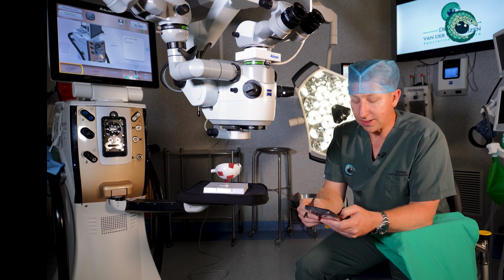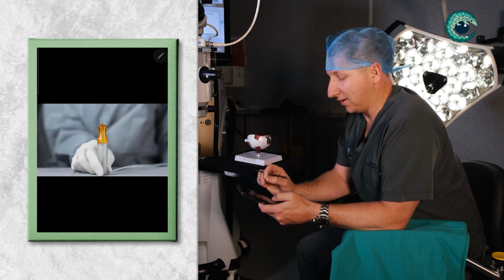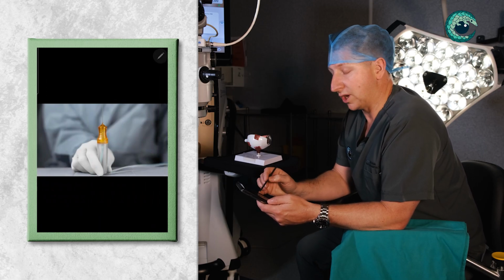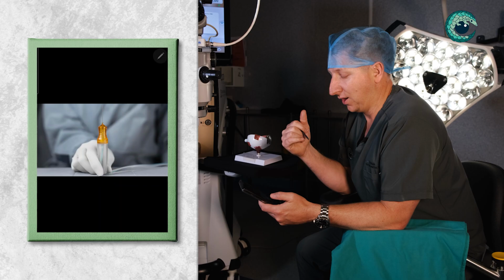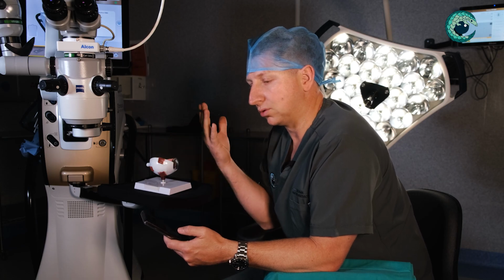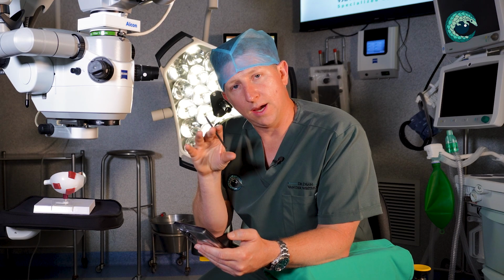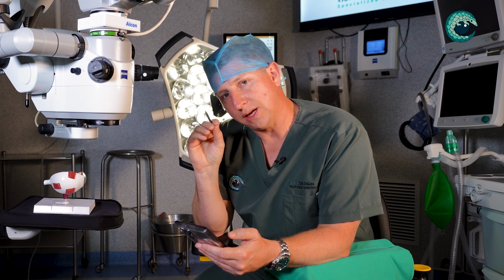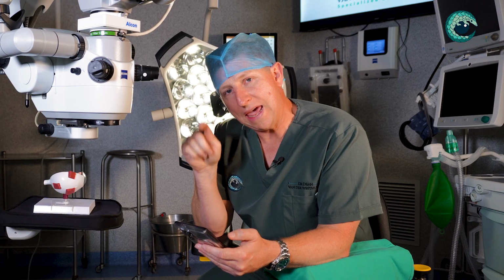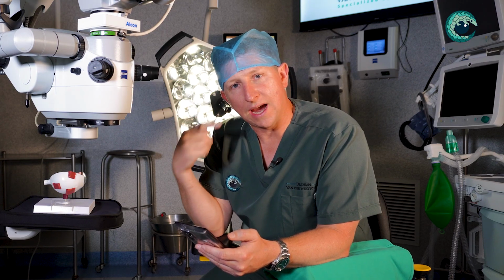In terms of instrumentation, I think the most important thing is the vitrector. So the vitrector is the tool that we use to cut and suck. People often want to know, why is this a special tool? Essentially, you can think of it like a vacuum cleaner. On the end of the vacuum cleaner is a very small blade inside the vacuum, and that is constantly cutting.